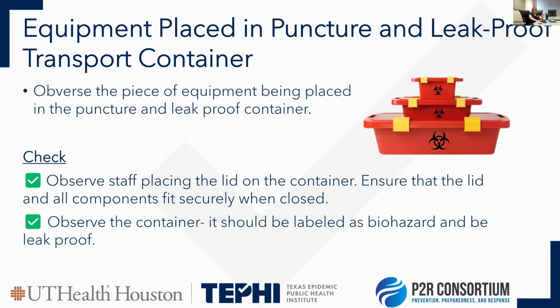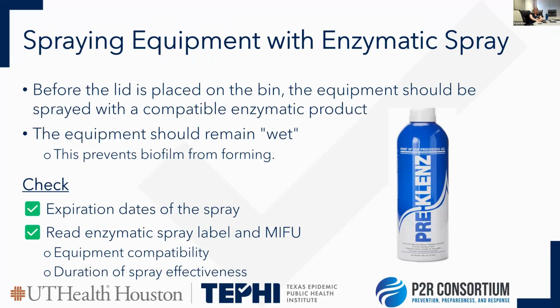After they wipe down and remove the gross debris from that piece of equipment, it goes into a biohazard, leak and puncture resistant container, as you see here, labeled with the biohazard symbol. The equipment should neatly fit in there with the lid on, and it shouldn't be too heavy to carry either.